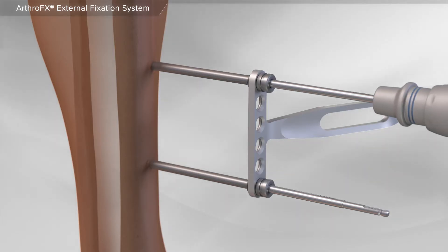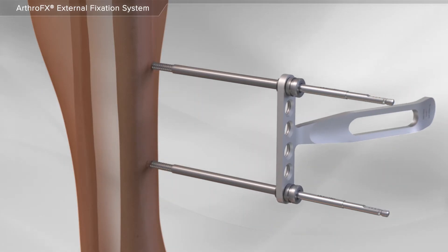With the use of special instrumentation, your surgeon places two pins in the bone just above the fracture.